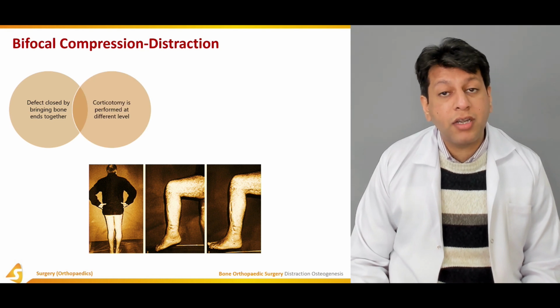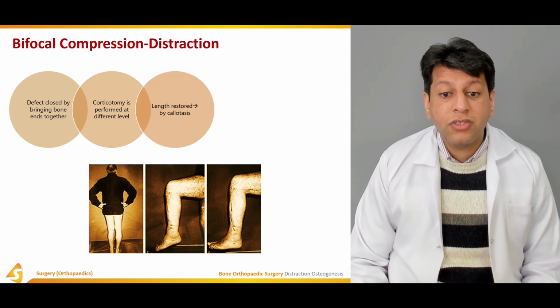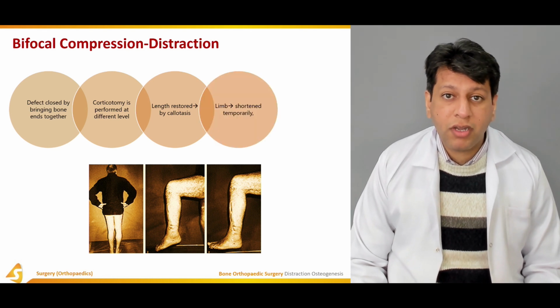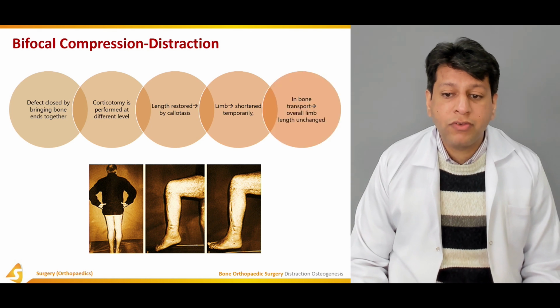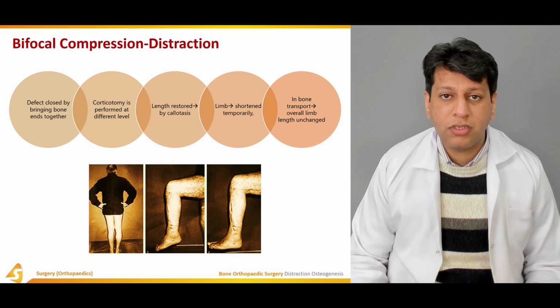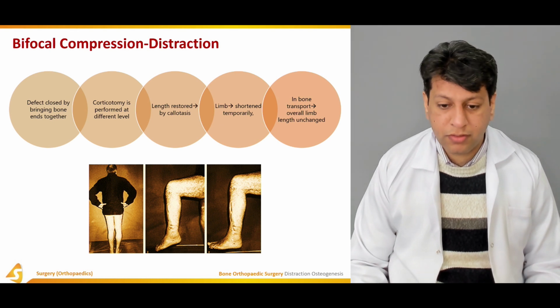Corticotomy is performed at a different level, then the length is restored, and the limb is temporarily shortened, but eventually with the use of Ilizarov, once the bone transport is complete, the overall limb length discrepancy actually disappears.